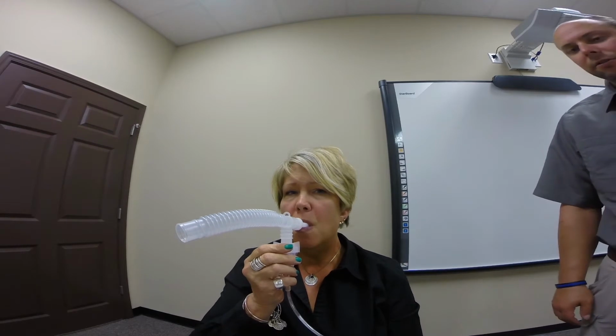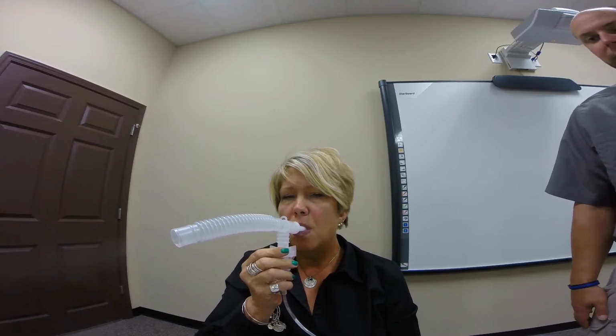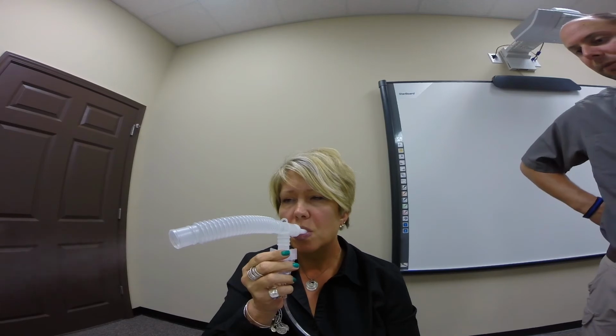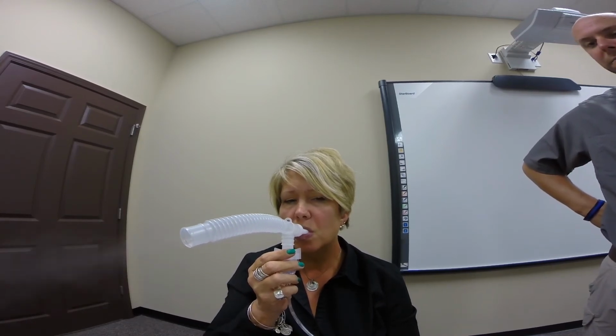And you want to instruct the patient to take a deep breath, hold it in as long as they can, preferably up to about 10 seconds, and then exhale slowly. The meds will take anywhere from 8 to 10 minutes to administer, depending on how quickly the patient is breathing.